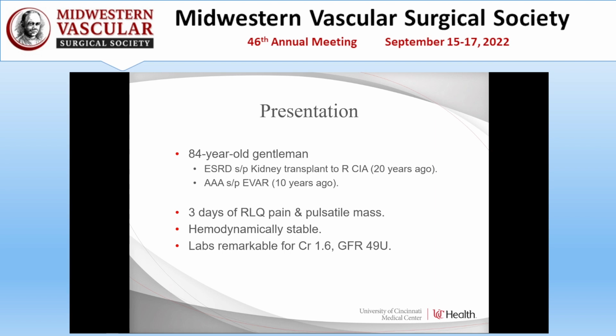Our gentleman is an 84-year-old with end-stage renal disease, status post kidney transplant 20 years ago. He also had an AAA repaired with an EVAR 10 years ago. He presented to our facility with a symptomatic aorto-iliac aneurysm. He was hemodynamically stable at the time with elevated creatinine.